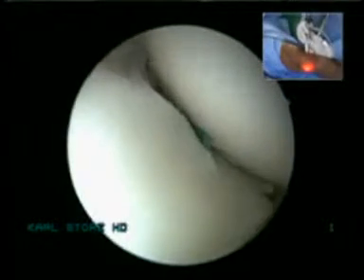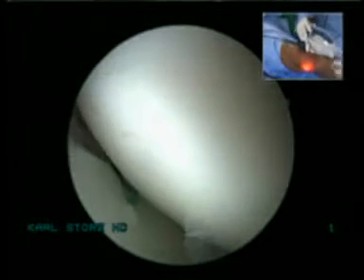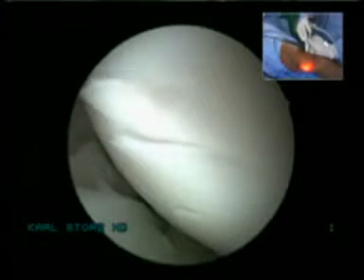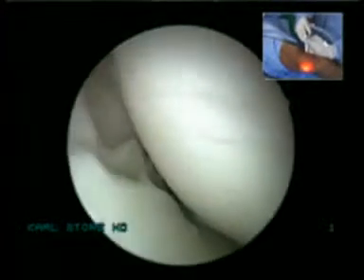So I'll just ask a quick question to the panel. I think how many meniscal repairs along with ACL? These days we are moving towards more meniscal preservation. Now, Ravi Gupta, do you always do a meniscal repair? That would make sense, right? With an ACL tear? When it is repairable.